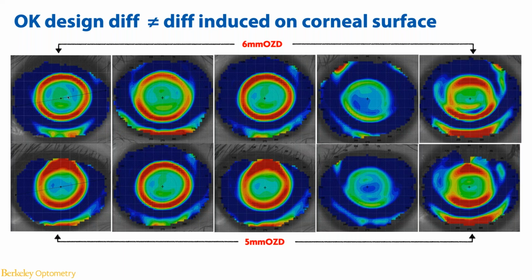This is such a great question. It shows that this doctor probably used a lot of CRT lenses. So my initial lens selection, I will not change the landing zone angle. But if I see the patient presented with excessive edge lift or insufficient edge lift, I do actually take into consideration that each degree of landing zone angle change will cause a slightly different change in the overall sag of the lens due to a wider distribution on the landing zone area.